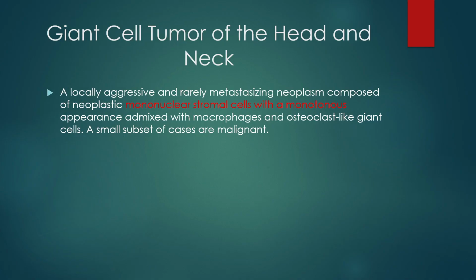this entity. But I just like to remind you that not all giant cell tumors have tons of giant cells. So you need to remember another characteristic finding really unique for this entity: this mononuclear stromal cell with a monotonous appearance.